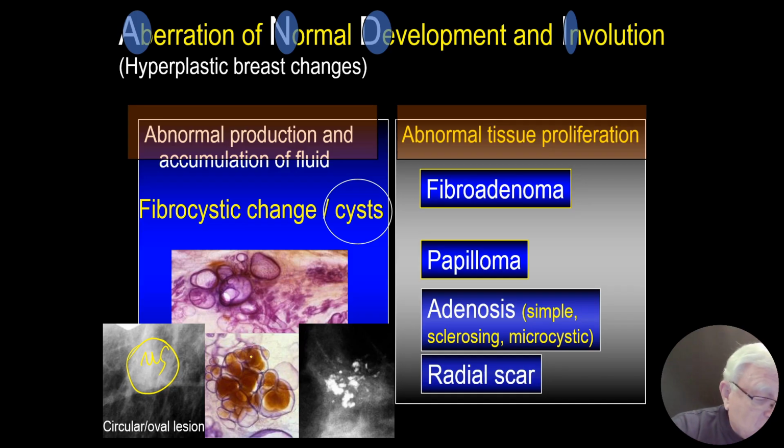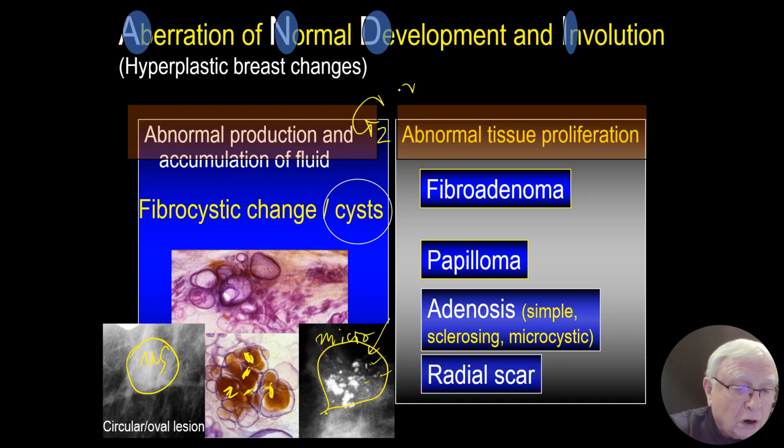And then, when it stagnates, then calcifications are going to be formed in a cluster. And a good radiologist also looks at how close the calcifications are, their density, size. They are tiny microcalcifications. Grade 2 carcinoma in situ with necrosis is produced within the TDLU.